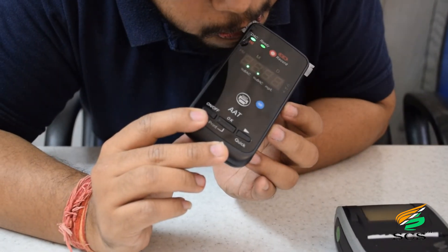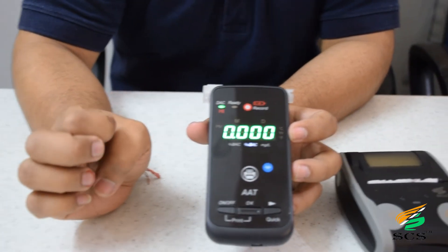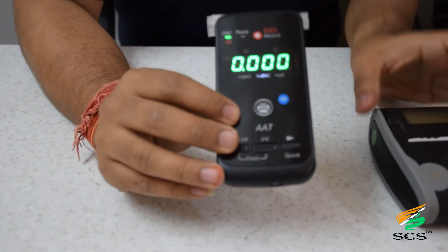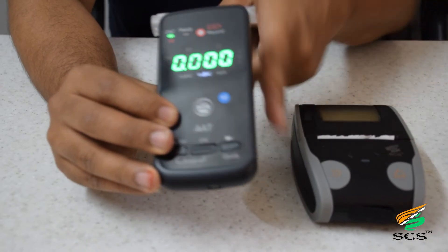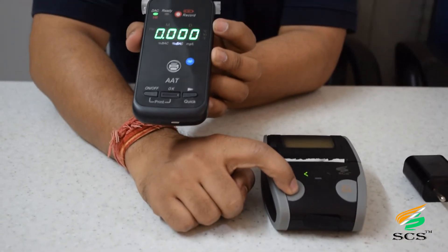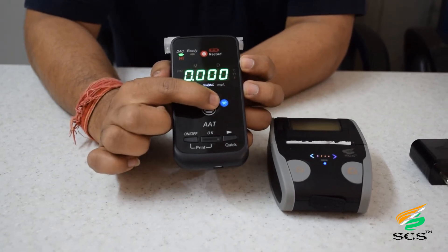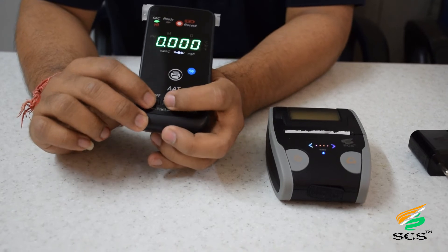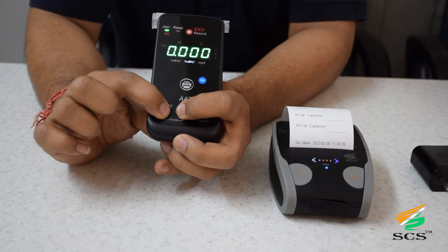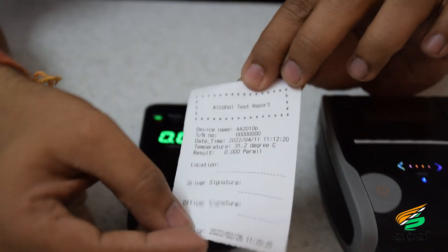Blow air through the mouthpiece. It shows 0 mg per 100 milliliters, meaning no alcohol found. This is the thermal printer — hold the power button for a few seconds to turn it on. It shows Bluetooth enabled. For printing, hold both buttons together.